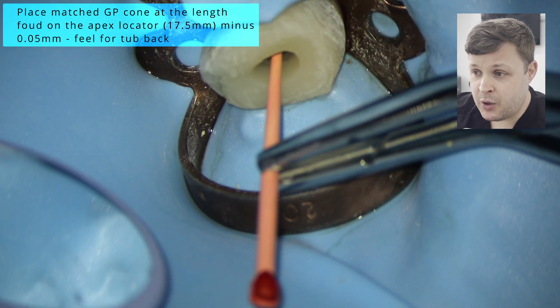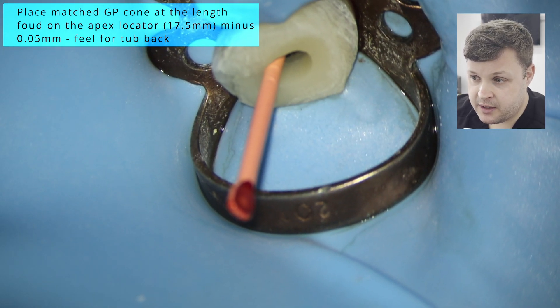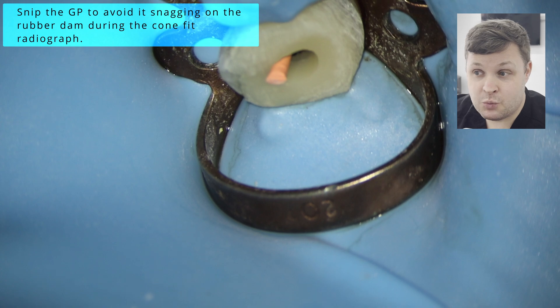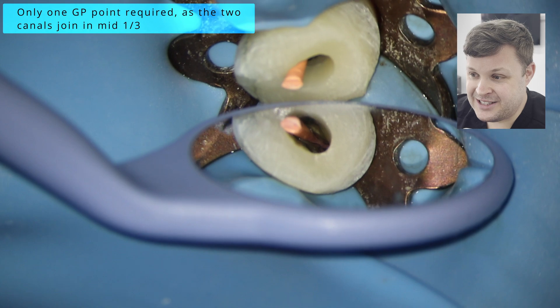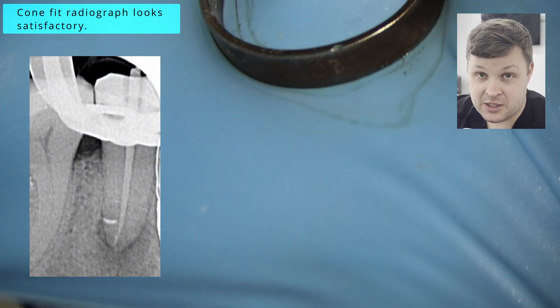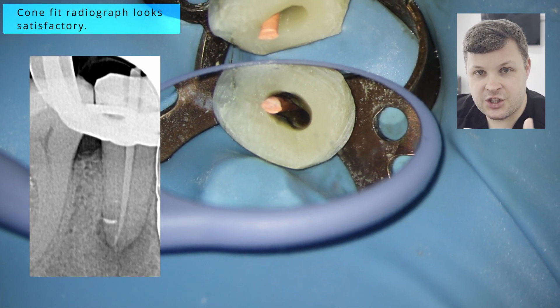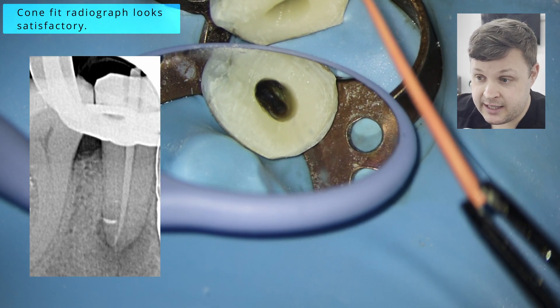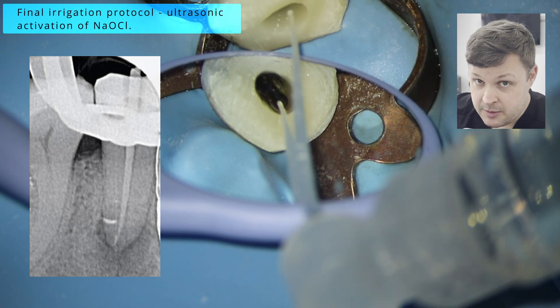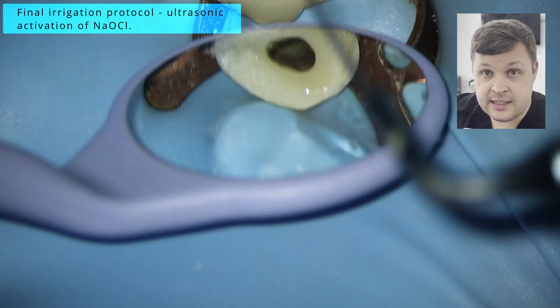Once we've shaped both canals we're ready to do a cone fit radiograph. In this case I know the two canals join in the mid-third, so just out of ease I'm going to use just one cone to length for the cone fit radiograph. What I like to do — you can see here it joins quite far up, especially visible with the microscope — is to just snip off the end of the GP cone because I feel it just doesn't get in the way. When you take your cone fit radiograph, it looks really nice — it's to length with a little bit of bend on the GP. That's something you need to think about when compacting it down.